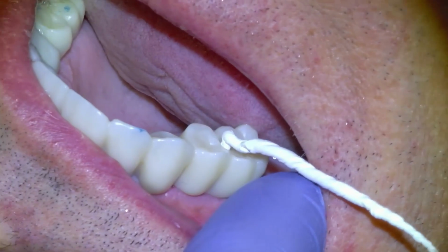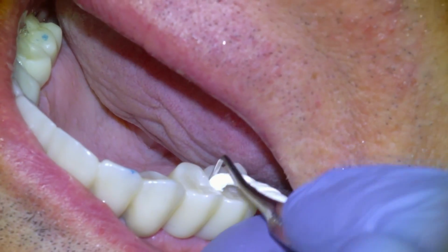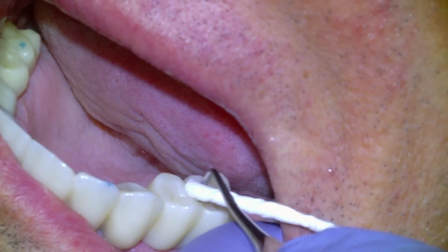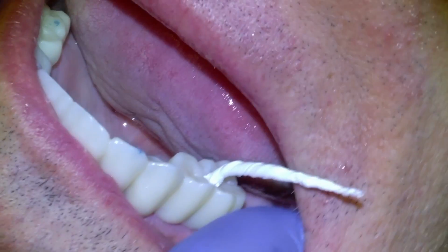And the reason that we do that is so that we can access the screw head in case we ever need to remove the bridge, which isn't a bad idea to do once every couple of years. Remove the bridge, clean the underside of it. Sometimes, calculus might build up a little bit on it, tartar that you can clean off, and then you can just put it right back in.